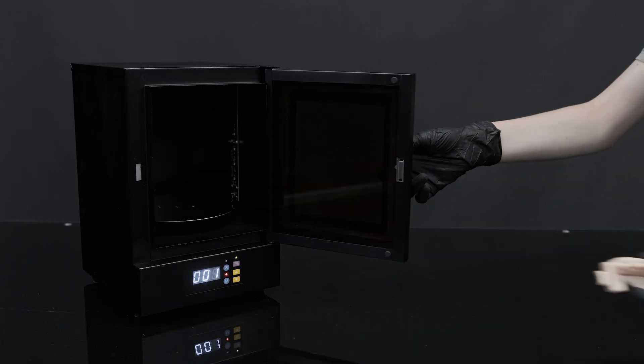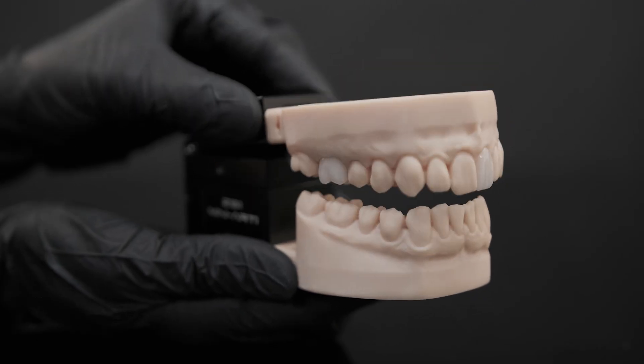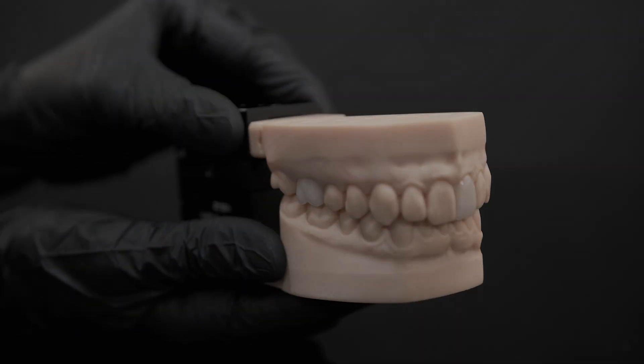Then cure the model together with the dies for another 10 minutes in the post curing lamp. Finally, verify the restoration fit and check the opening, closing, as well as lateral and other occlusive movements with the functional and easy to use Zirconzon Mini RDZS-1.